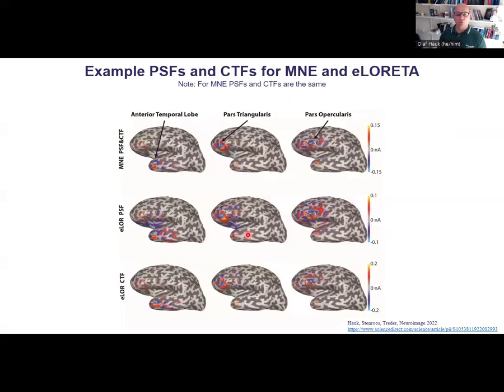Yes, but before we actually look at these values, we check out some individual point spread and crosstalk functions. I think that's always a good idea. If you know which regions of interest you're interested in, then it's always nice to visualize these to get an idea of what spatial resolution you've got. So in this case, well, it looks a bit complicated, but hopefully it will make sense.